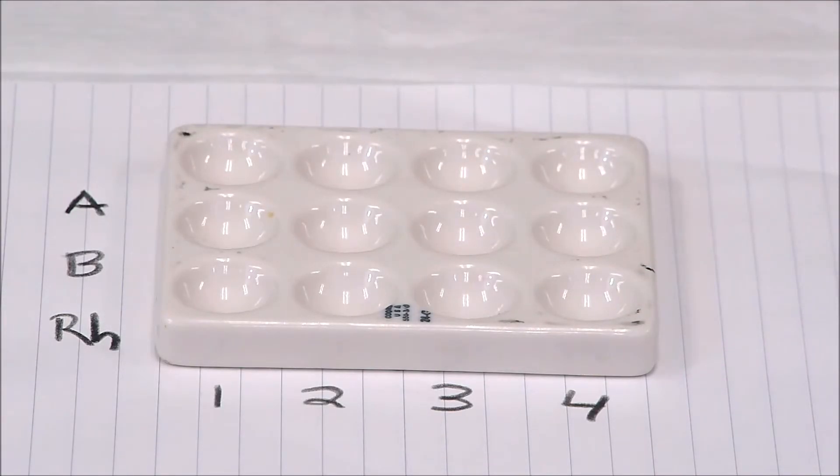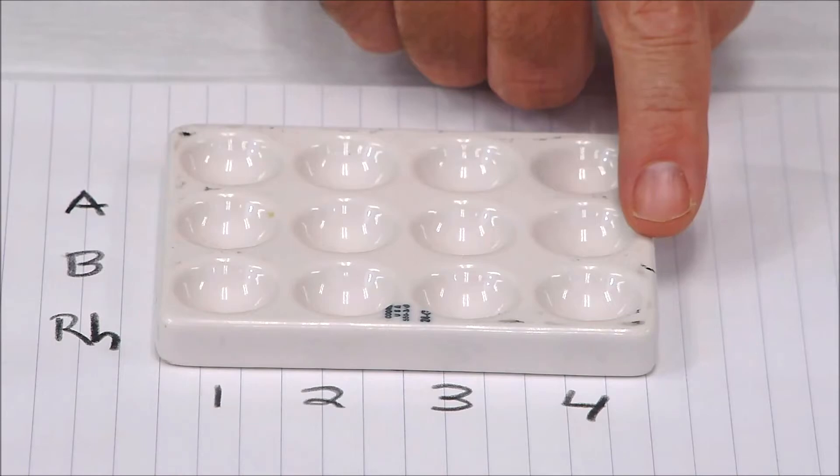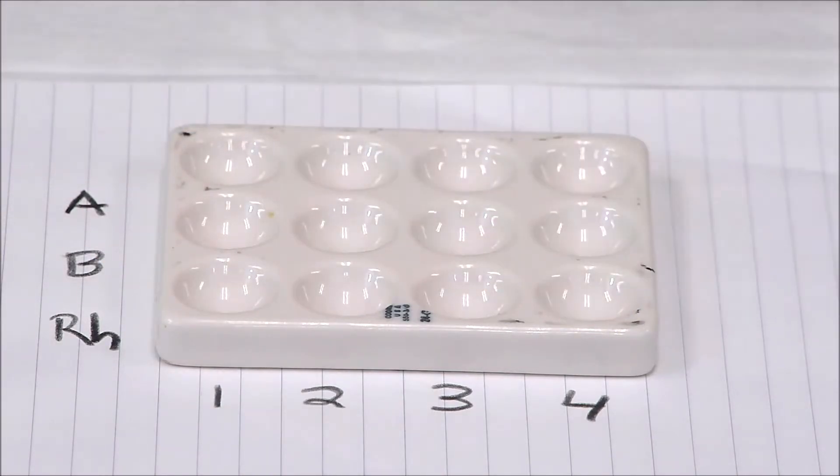We're going to have three drops of each of those samples. To the first drop we're going to add anti-A anti-serum, to the second drop we're going to add anti-B, and to the third drop we're going to add our anti-Rh or anti-D.